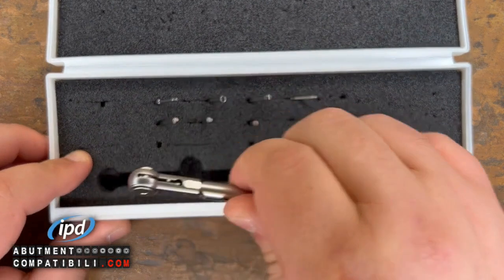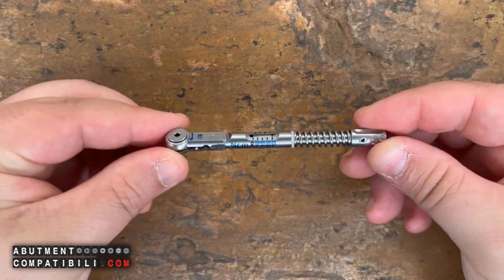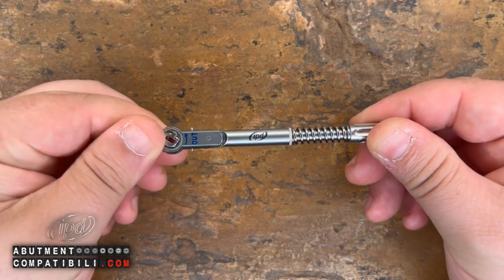Let's take a look at the ratchet itself — specifically what the tool is, how it should be used, and what its features are.